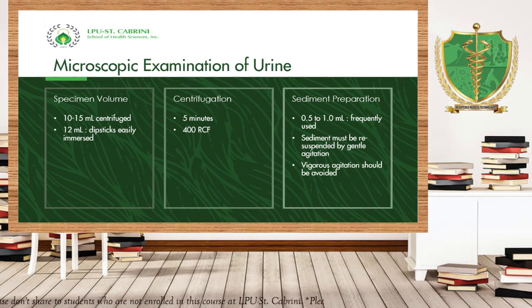And it must be resuspended gently, with gentle agitation, not excessive agitation, because excessive or vigorous agitation would destroy the WBC and RBC, or the other sediments that can be seen in the urine.